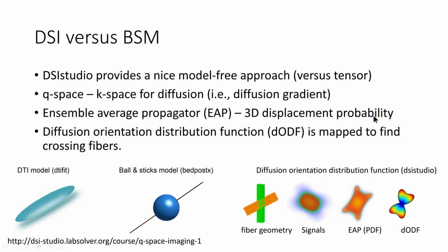So it's a probability in which you have a diffusion along that space. And again, when you're talking about ways of mapping those roads in those weird crossover areas, and that's really the focus of what we're talking about, those crossover areas, you have probabilities. What are the options that you have for a tractable path? Another term you'll hear a lot is HARDI, the high angular resolution imaging that you can use to try and pick up those crossing fiber paths.